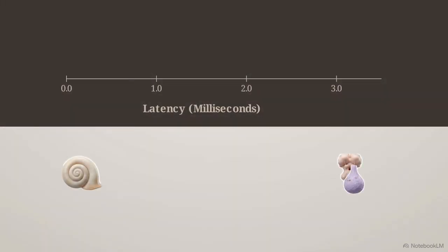Looking back at the ABR graph, we map that electrical starting line. Exactly 1.5 milliseconds after the stimulus, the first peak emerges. This is wave 1, generated at the distal 8th cranial nerve, the vestibulocochlear nerve, as the signal leaves the cochlea. An absence or delay at this exact mark indicates immediate peripheral failure, often pointing to cochlear ischemia or infarction before the signal reaches the brain.